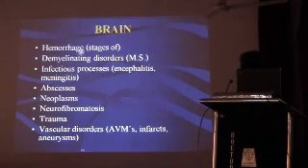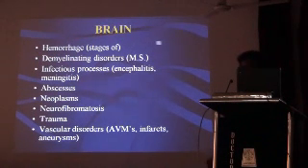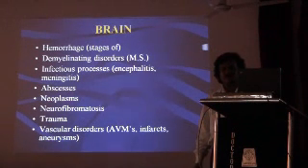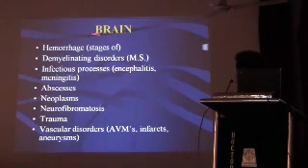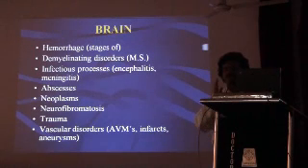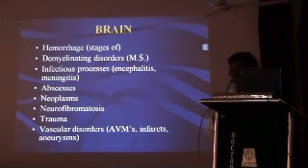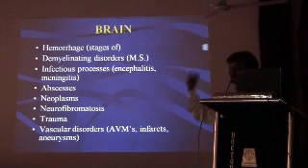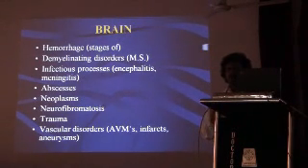As far as brain is concerned, dating of hemorrhage is important. With CT, we say yes, it is a resolving phase of acute, etc. For any white matter lesion, especially multiple sclerosis, MR is the investigation of choice. And put gadolinium, if it enhances, you can see the activity, and after therapy, how much is the progress of treatment.